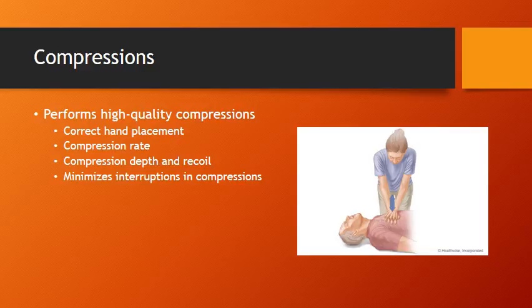Deliver 2 breaths so that less than 10 seconds elapse between the last compression of one cycle and the first compression of the next cycle. Compressions resume immediately after a shock or no shock indicated.